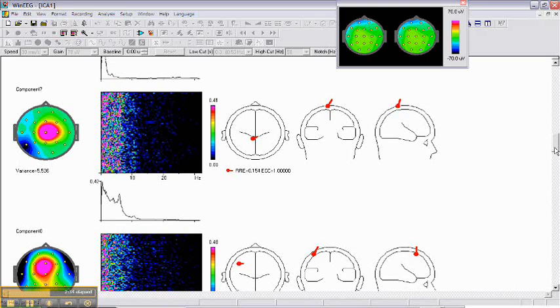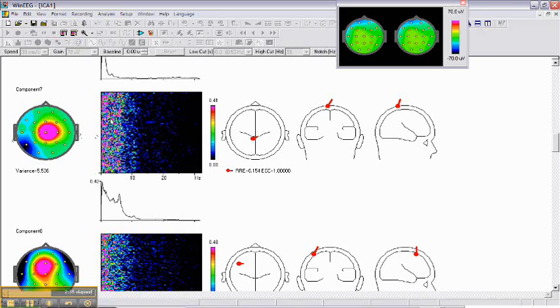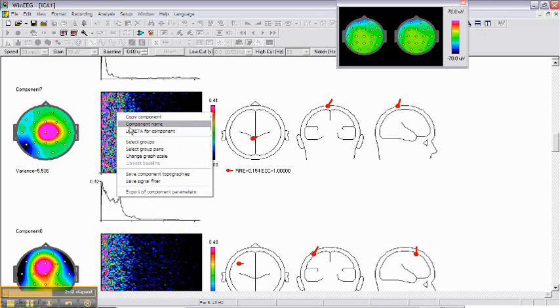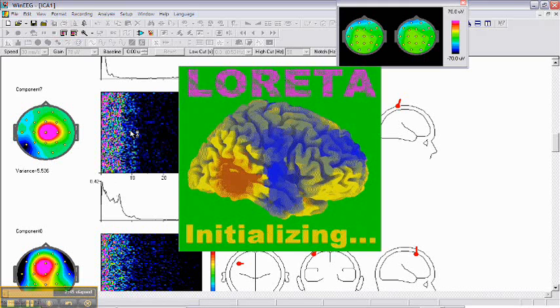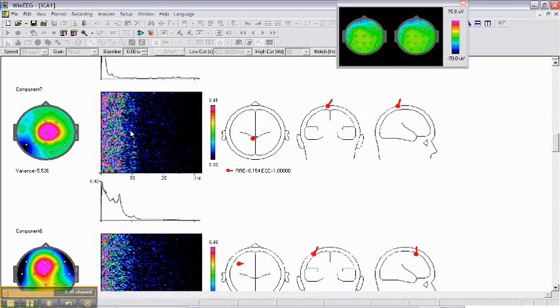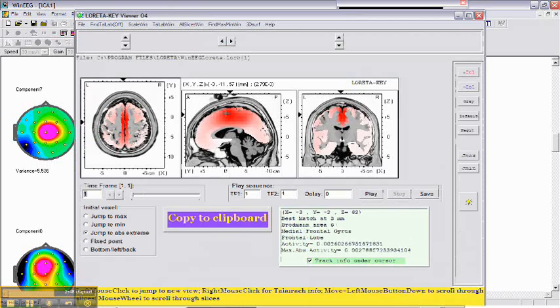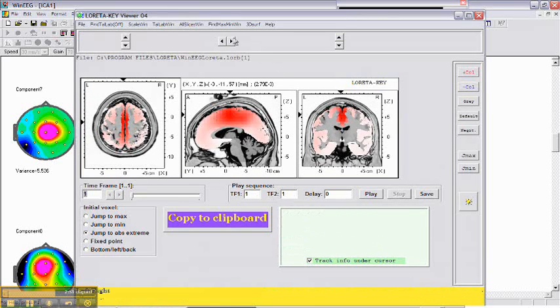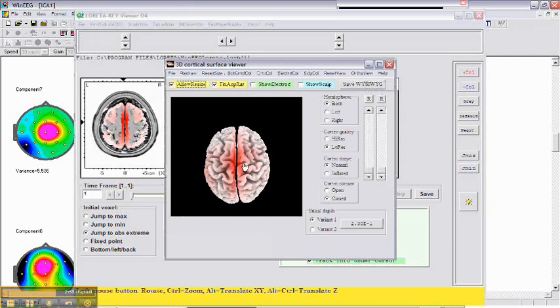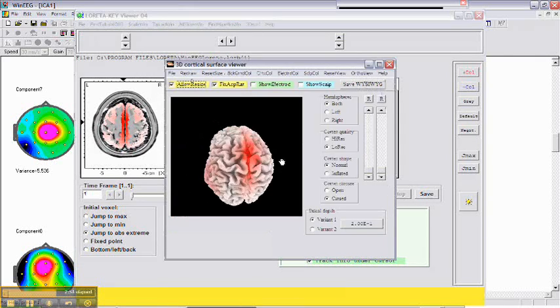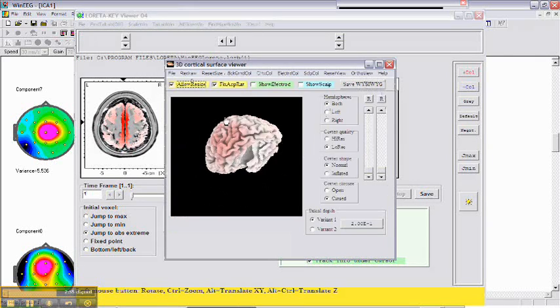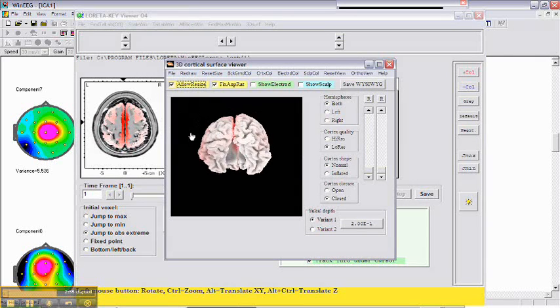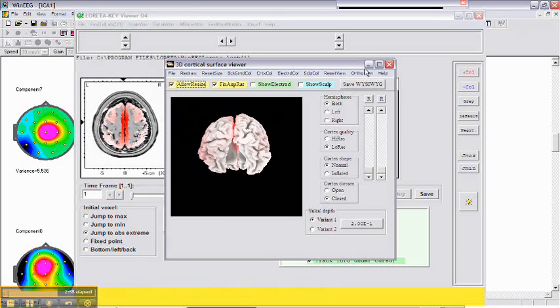And then you can compute for this component. You can compute Loretta image. So go to Loretta for the component. Click and you compute Loretta for this component. Okay, three-dimensional image.